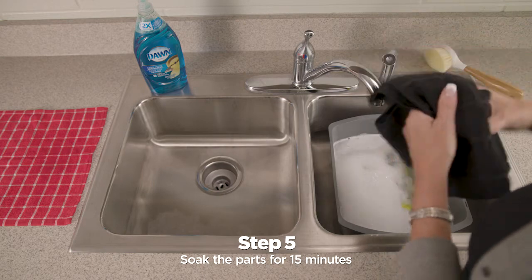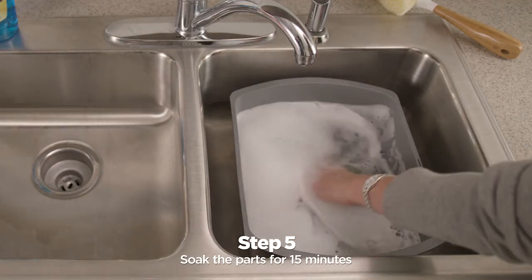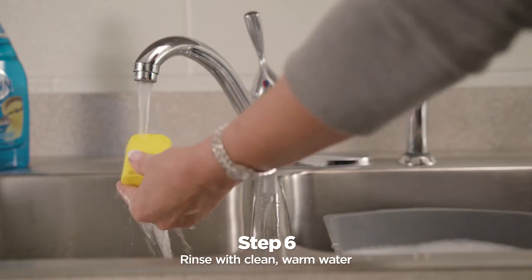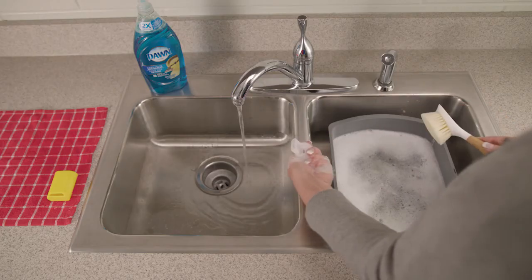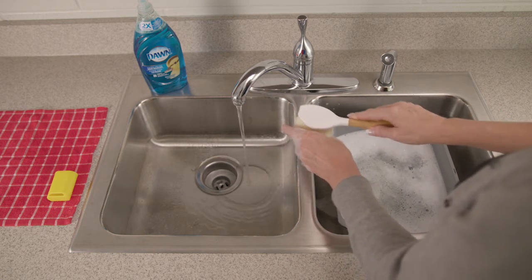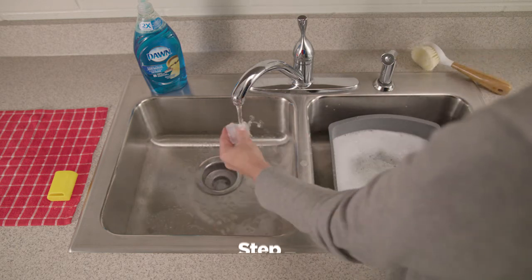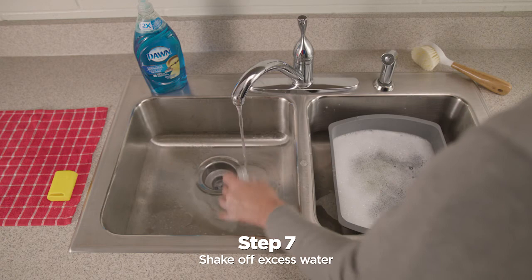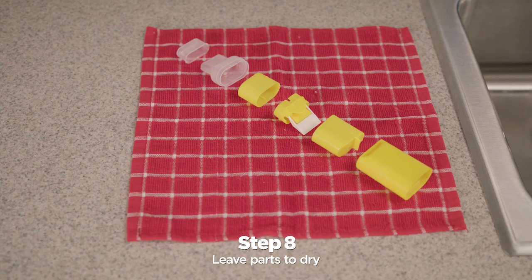Wash the parts by soaking them for 15 minutes, moving them around from time to time. Then rinse with clean warm water. Look at the parts — if they are still not clean, wash them again. You can use a soft, lint-free cloth or a soft bristle brush to help clean them. Shake off any water from each part, leave them to dry, and make sure there is no soap or water left in them before you put them back together.